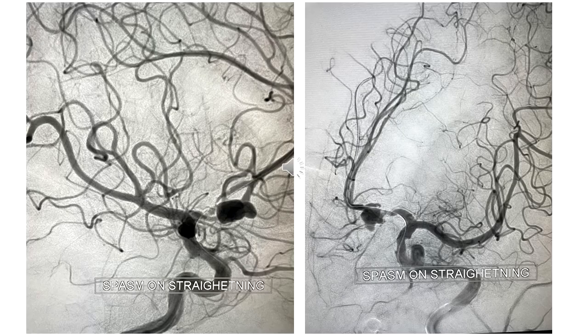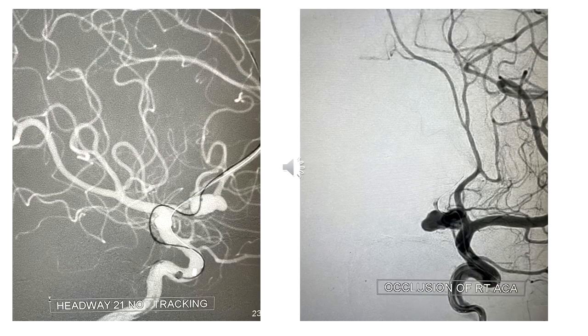microcatheter. See very well here that there is severe spasm of this artery caused by the microwire itself, because you can see there's a very sharp loop coming into the aneurysm, involves the neck and then comes here. So this segment has got straightened and that has caused this severe spasm. I took a Headway 21 over the Neuroscout. However, it kept looping. On looping, the spasm disappeared. However, when the system straightens, there would be spasm.